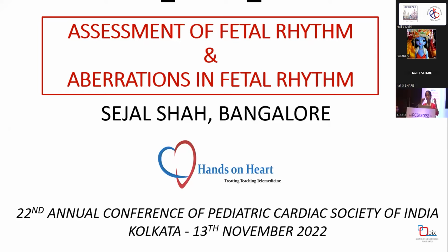Good morning, friends. Our next topic is on assessment of fetal rhythm and its aberrations. The assessment of fetal rhythm is a little challenging because, one, we do not have an ECG recording possible.